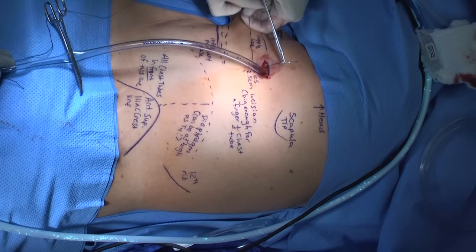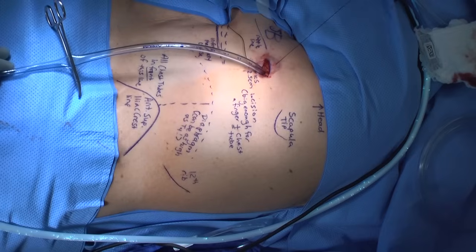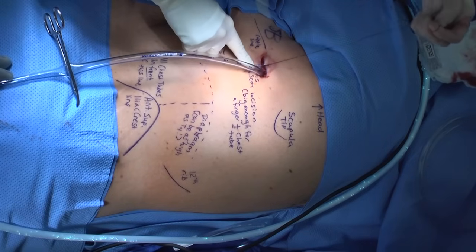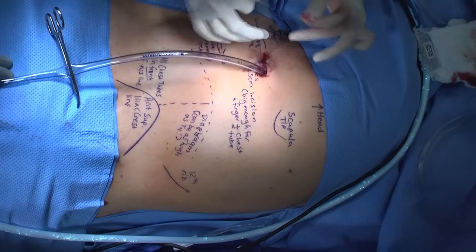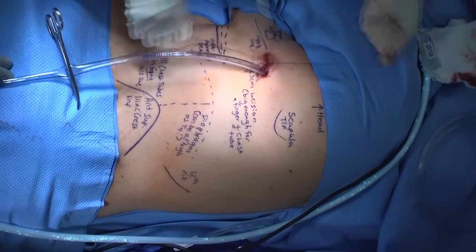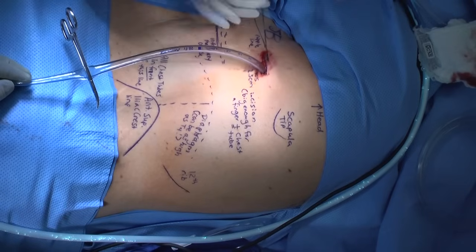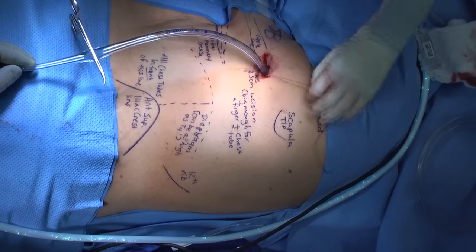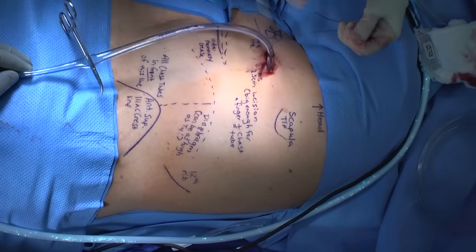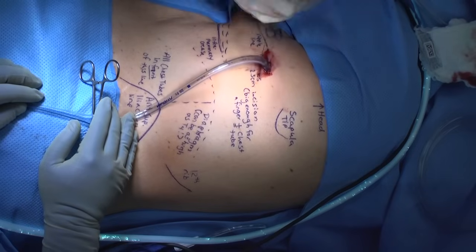Securing the tube is very important — just as important as placing the tube. We like to secure our tubes with a large silk suture. It is important to take large bites of the skin so that the tube will not be pulled and the suture will not be pulled through the skin. Tie many knots. Once you have a little bit of a tail, go around the chest tube several times and cinch down to create a small waist on the chest tube — not enough to impede drainage, but enough to hold it securely. Put a couple of additional knots, then go around a second time to re-secure the tube. Chest tubes should never accidentally fall out due to an inadequately secured tube.